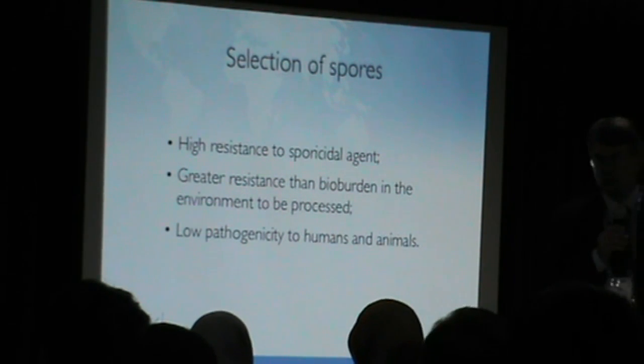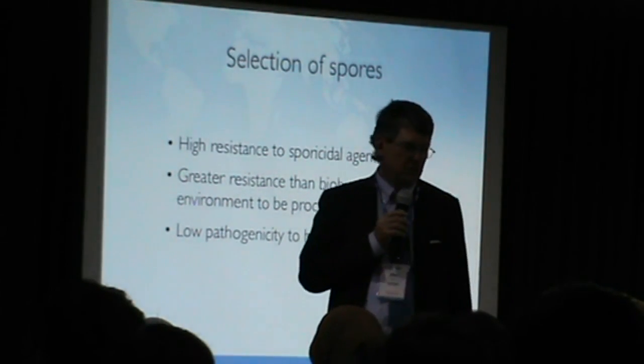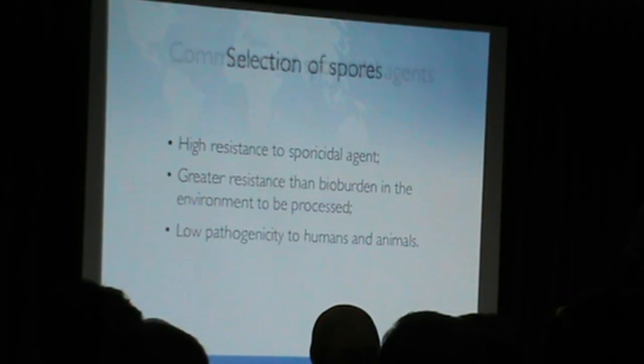They should have low pathogenicity because you are handling this microorganism and you don't want the humans and the animals to be affected.